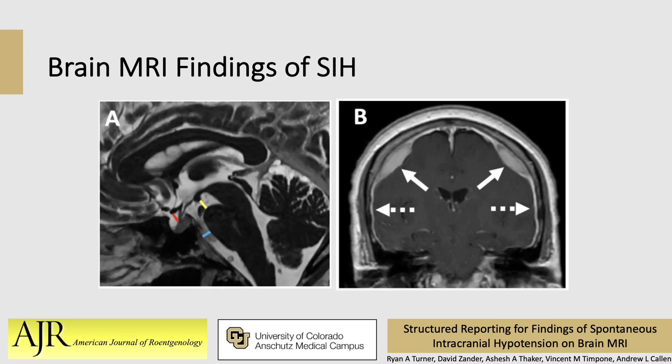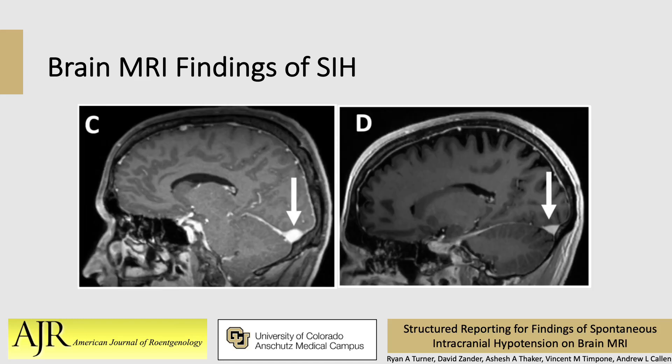To review imaging findings that can help evaluate SIH: image A shows normal appearance of suprasellar distance shown by the red marker, mamillopontine distance by the yellow marker, and prepontine cistern by the blue marker. Image B shows a patient with suspected SIH, the presence of subdural collection indicated by the solid arrows, and pachymeningeal enhancement by the dashed arrows. Image C shows an abnormally engorged transverse sinus with an upward convex superior margin, and image D shows the normal flat appearance of the transverse sinus.